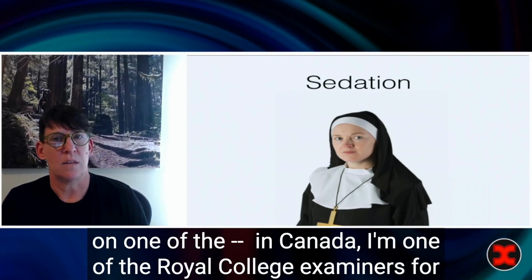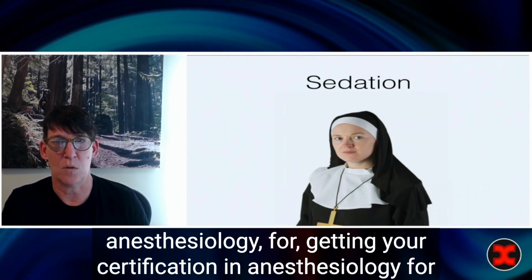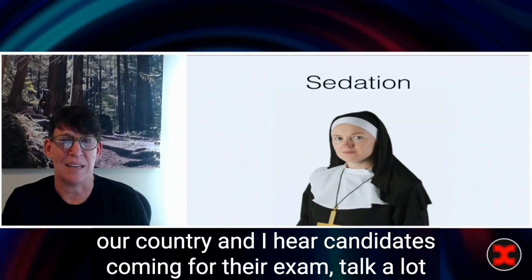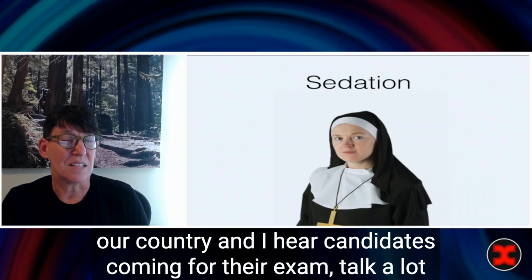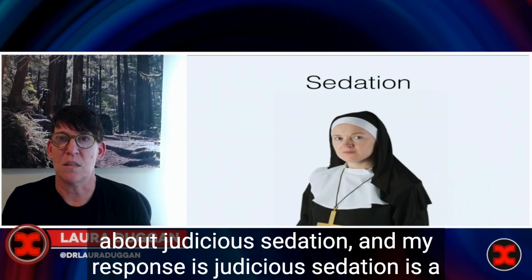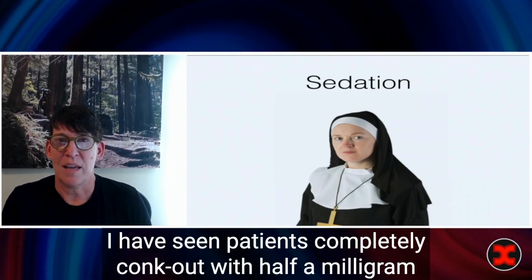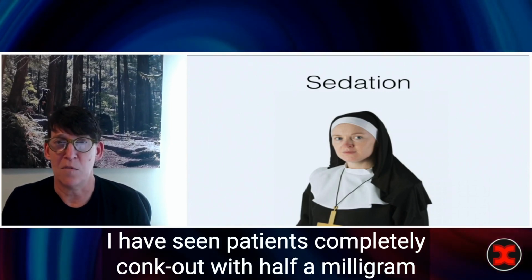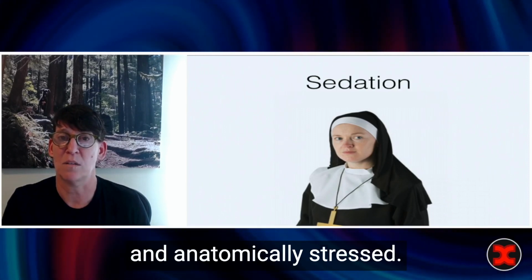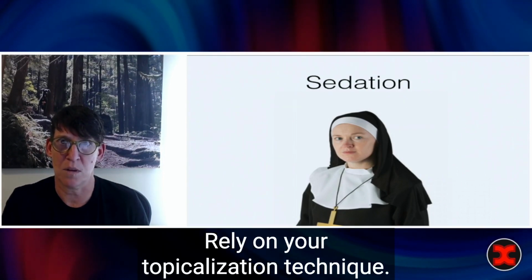And disclosure, in Canada, I'm one of the Royal College examiners for anesthesiology, for getting your certification in anesthesiology for our country. And I hear candidates coming for their exam talk a lot about judicious sedation. And my response is, judicious sedation is a descriptor only made in retrospect. I have seen patients completely conk out with 0.5 milligram of midazolam, particularly if they are physiologically stressed and anatomically stressed. Do not sedate these patients. Rely on your topicalization technique.